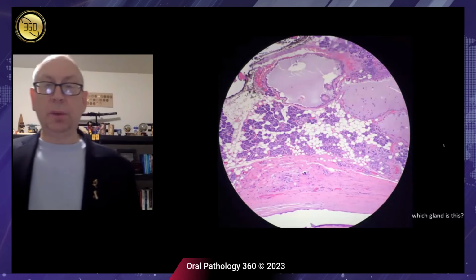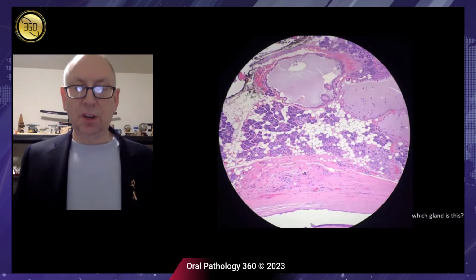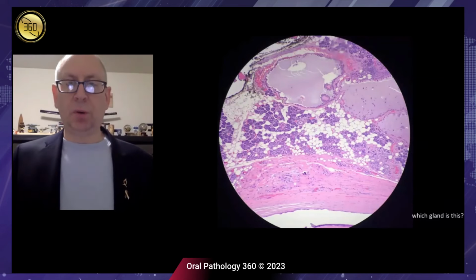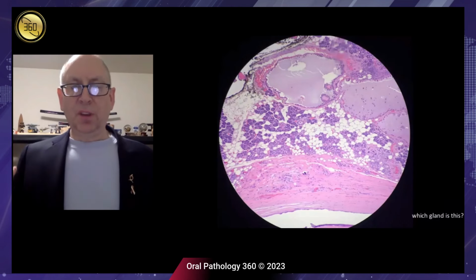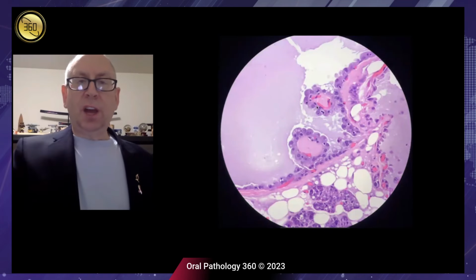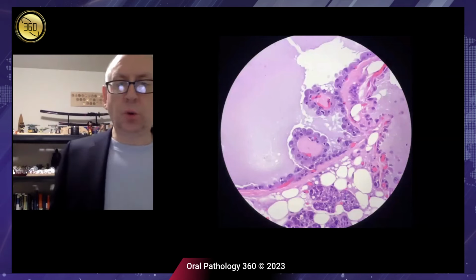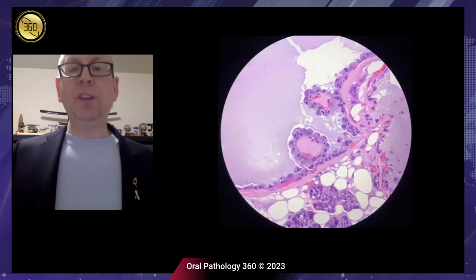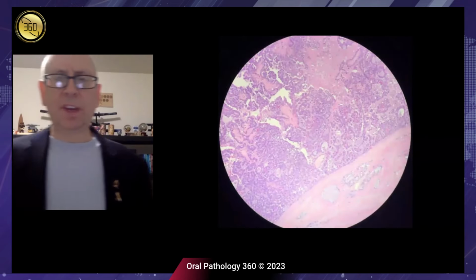But when we start going a little bit higher power, we will start to see cystic areas that have some sort of secretion in the center. So we start thinking about, okay, what are our tumors that have some kind of secretory component? So acinic cell carcinomas, mucoepidermoid carcinomas, secretory carcinomas. And then we start looking high power. Now we can start teasing out the cytologic features of these. So what I know is I have cells that look somewhat basophilic. So I can start saying, okay, maybe I'm leaning towards acinic cell carcinoma here because of the basaloid or the basophilic characteristic.